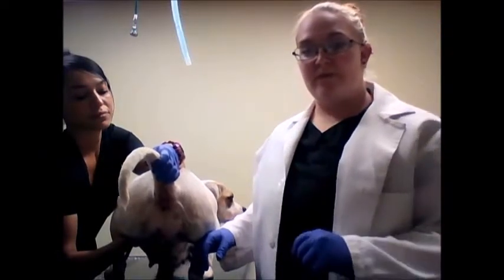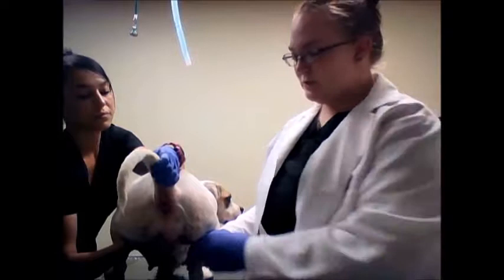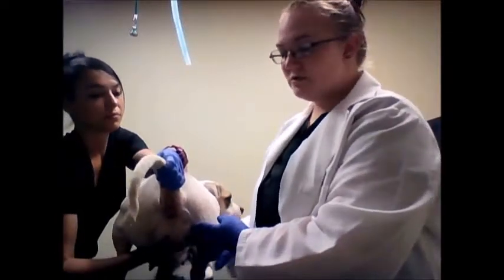I'm Aisha Hopper. I'm in VETT 222. I'm going to do task number 13 now, which is a vaginal cytology.